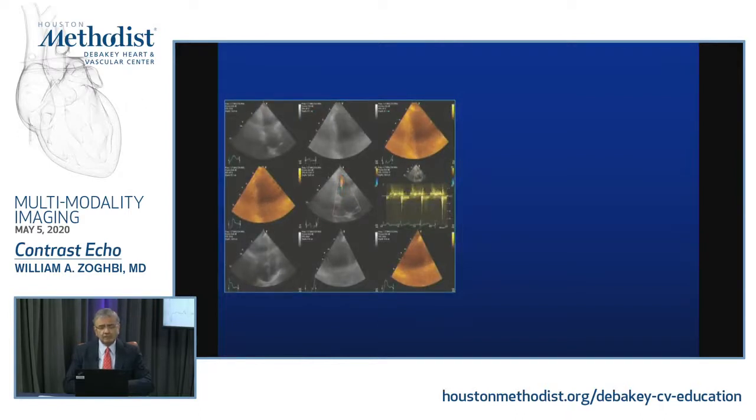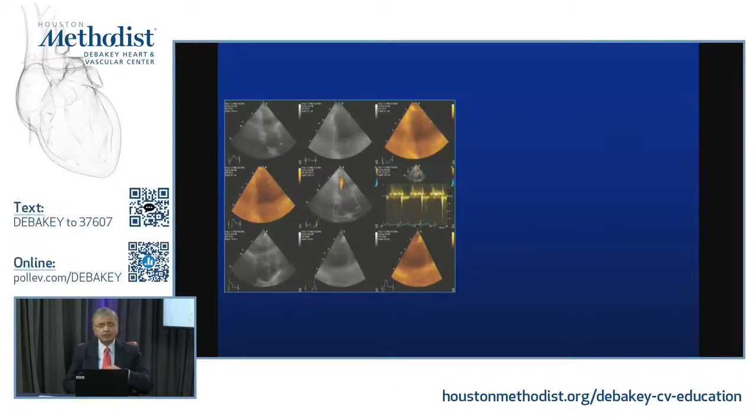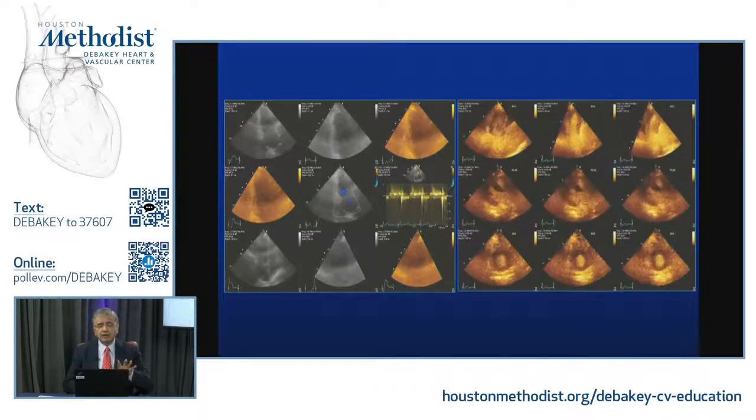I show you this, and we could show many examples, right? As I always ask people, estimate what your ejection fraction is and what your wall motion is. Most people would not venture. I would not venture into that. And it sends a recommendation to people who are not using contrast at all in the laboratory. It's almost like turning the light on, from an uninterpretable study to quite an interpretable study. So this is the same patient after contrast. So don't tough it out. And unfortunately, the reimbursement is the same, whether I say technically difficult study, cannot interpret, or actually now I can interpret it.